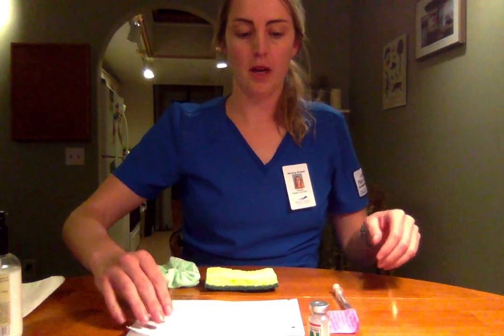So Abby, today I'm going to be administering your medication of 26 units of NPH insulin into your abdomen. You're going to feel a light poke, but it shouldn't hurt. Please let me know if you do have any discomfort. Do you have any questions? No questions.